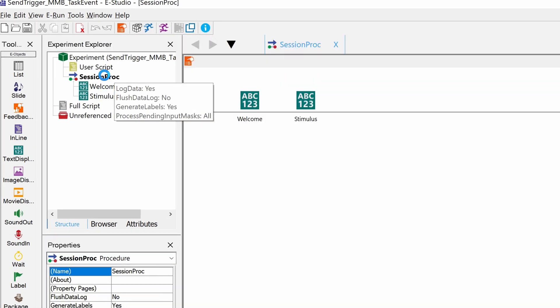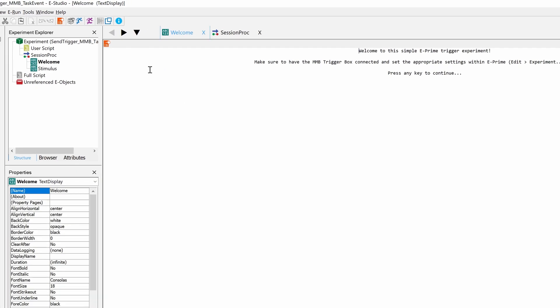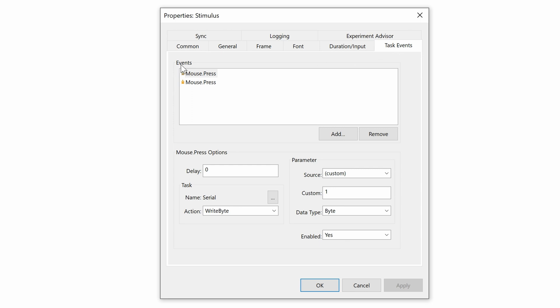The experiment I've prepared is very simple. It consists of two text display objects allowing the user to send triggers upon a mouse click. As you can see, I've already added two text display objects to the session procedure — starting with a welcome text and another with instructions on how to send triggers and end the experiment. Under the Task Events tab, we can tell E-Prime when to send a trigger and which trigger to send. I've added two mouse event listeners: the first sends trigger code 1 when the user's mouse is clicked; the second event looks for the exact same mouse click but waits 20 milliseconds, then sends trigger code 0. Since the DSi requires a trigger pulse width of 20 milliseconds and we have the MBTS set to Simple Mode, we need to pull all lines low again after 20 milliseconds by sending a 0.